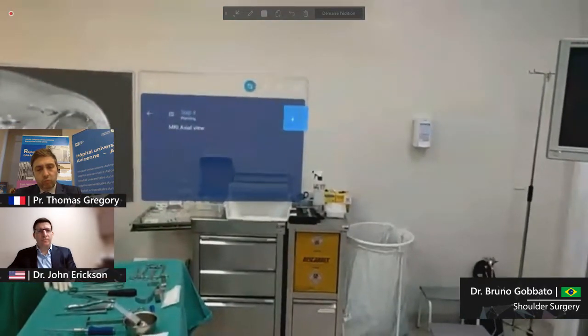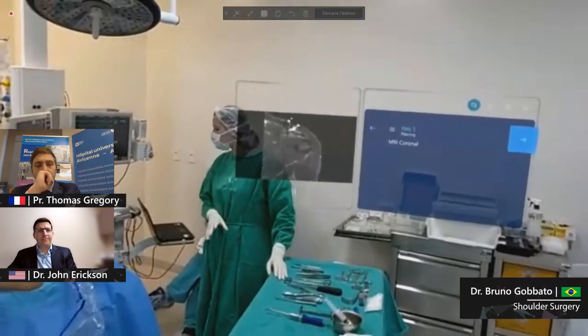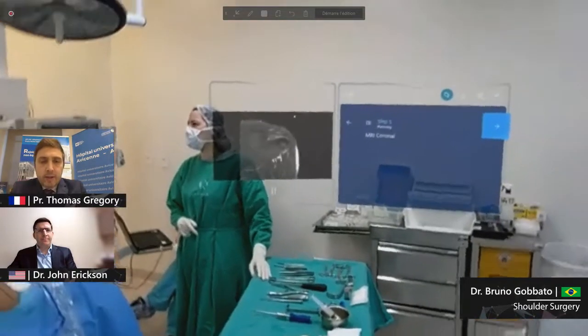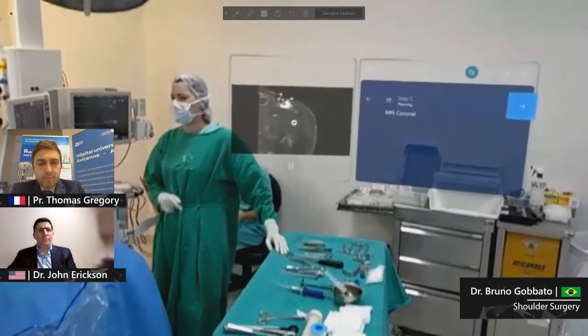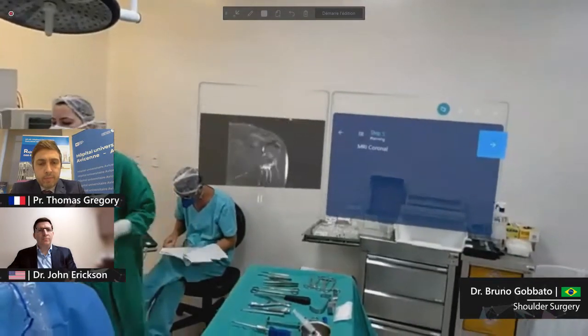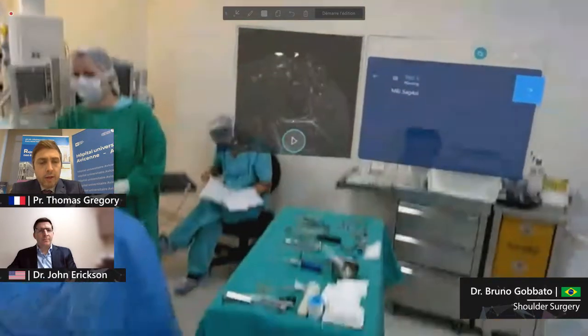on the arthroscopy. The coronal view. Do you have something in mind? He has some bursa. I'm not sure if this is artifact or not, but this patient has pain for one year. So we are going to do an arthroscopy later.